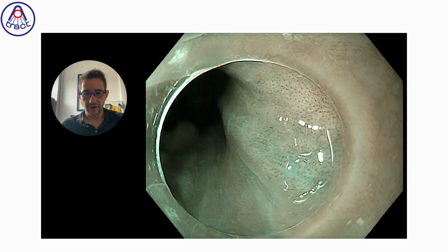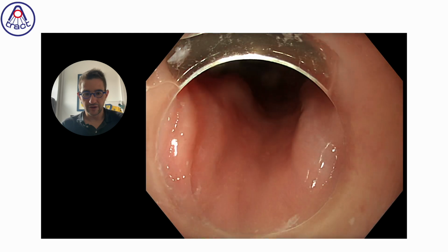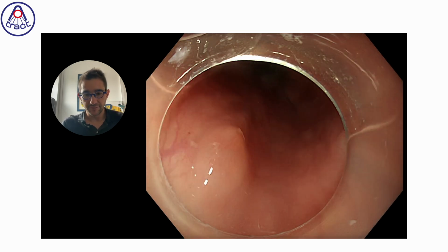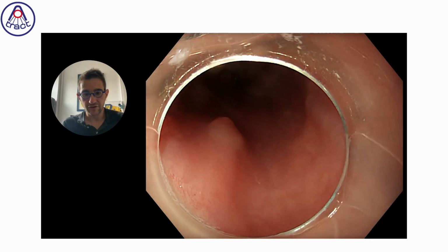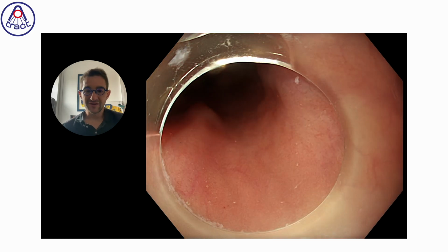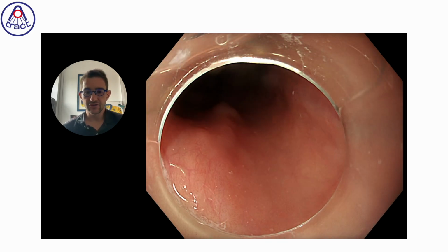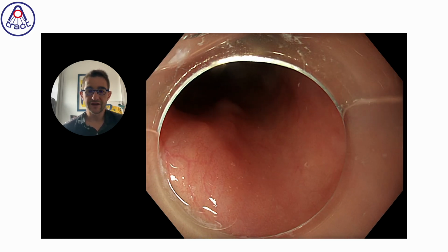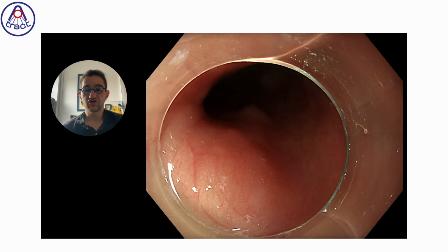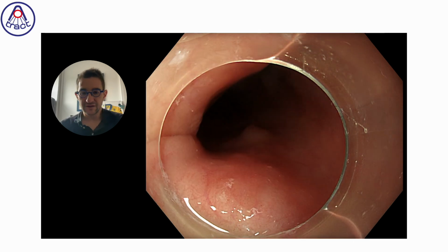So here we are in front of the lesion. You will see it soon. It is a very small lesion, a tiny submucosal tumor of 3 or 4 millimeters. But the ultrasound was not perfectly clear to be sure if it was possible to dissect between the lesion and the muscle, or if it is touching or tracting the muscle.